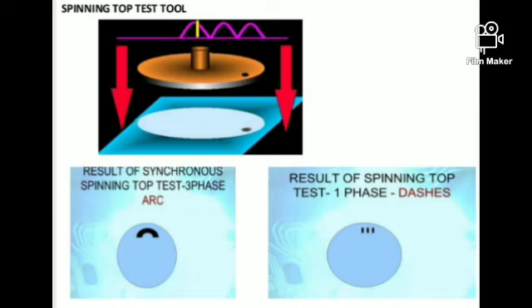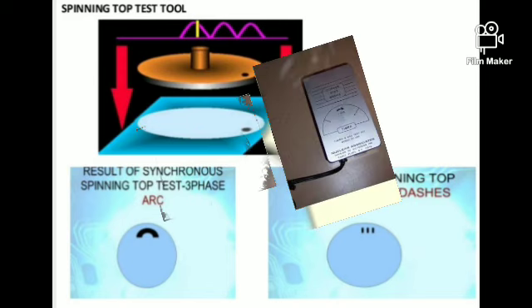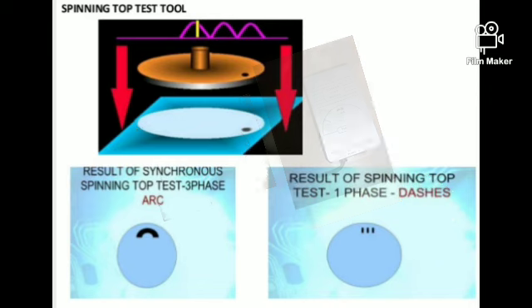The next thing is you switch on the exposure, and there is a foot pedal; once you press it, the spinning top starts to move. Keep in mind that the exposure and the press should happen at the same time. Then you can record for 70 kV how much time it took, and for 80 kV how much time it took, how many points or slit patterns you can see, and the number of arcs. All of these should not cross the tolerance value of 10%.